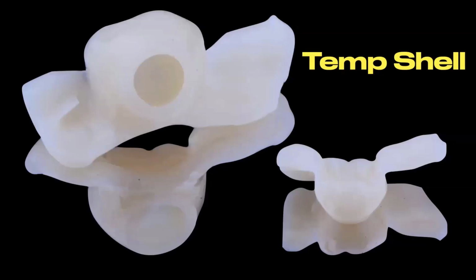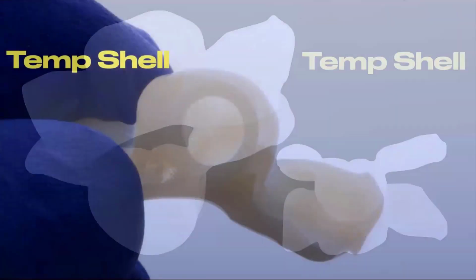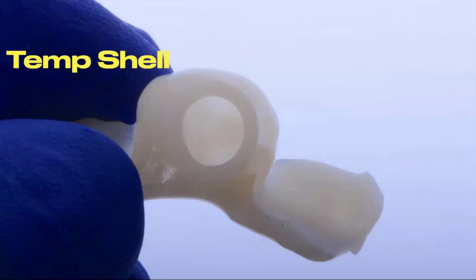It allows us to really get that in and stabilize what we need to do and how we go about it. And that temp shell, like I said, the wings on these temp shells are pretty cool because they can help you line up the teeth where you want them to be, so you can really lock things in and get a great result. And you want to really spend the best time you can, or the most time you can, getting this right.